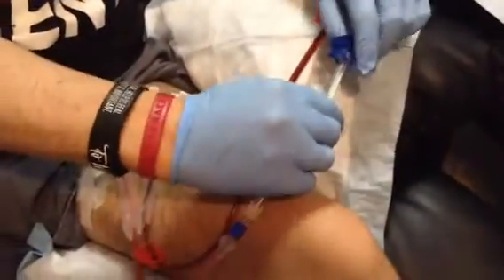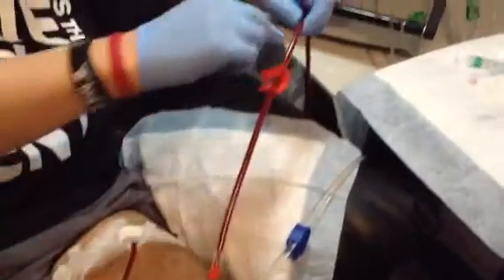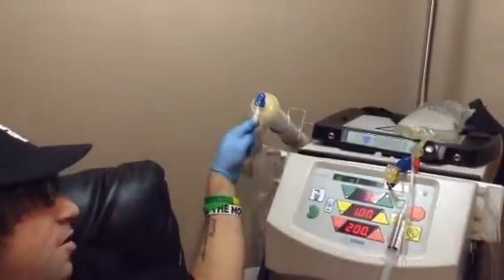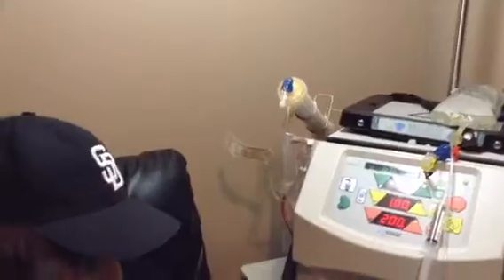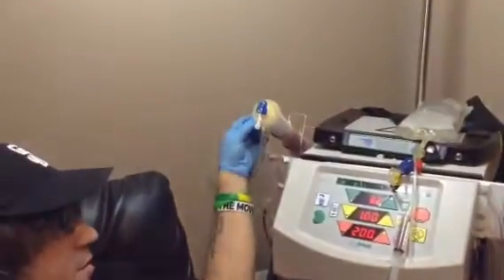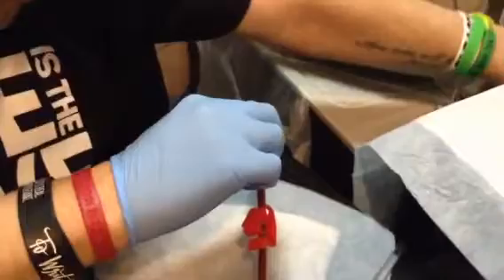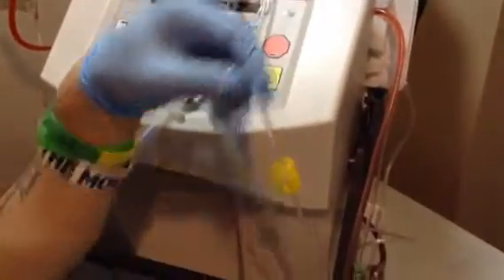Now you can see the blood is leaving my body to be cleaned by this machine. This is called a dialyzer — there are fibers in here that clean the blood. Underneath in this cabinet there's something called dialysate, and that meets the blood here and cleans it. The waste comes out through this yellow line — the color represents the color of urine, the waste product. That's how the blood is cleaned.